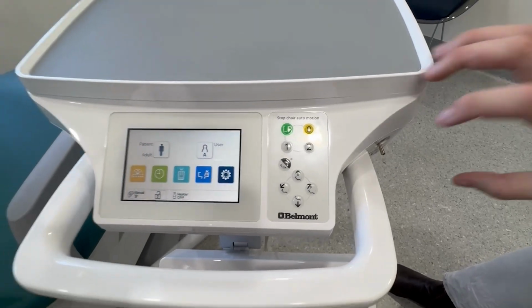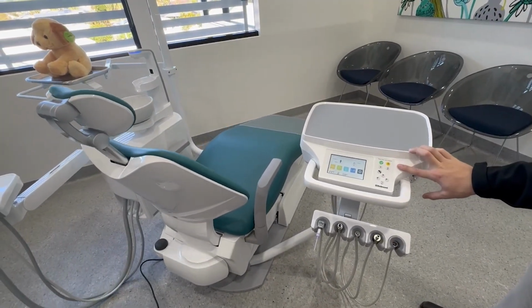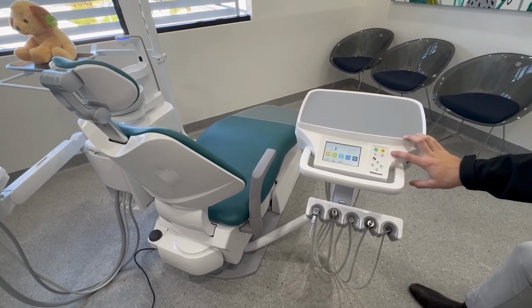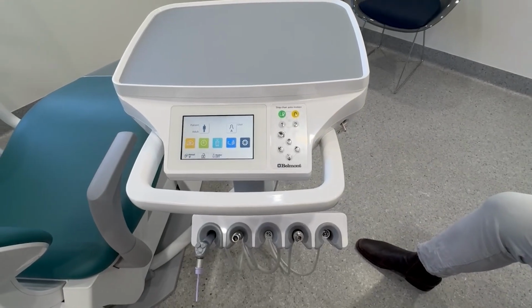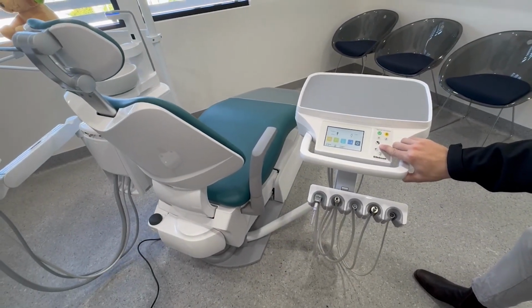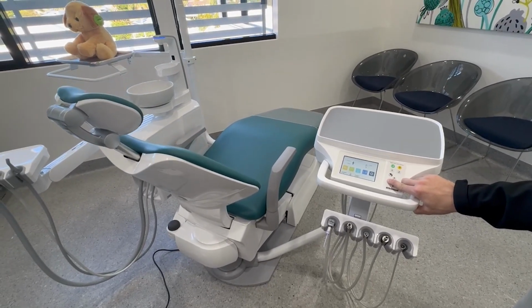Above that, we've got presets. Now 0, that's our entry-exit level. So we hit 0, usually lowest position, backrest up. We can preset that if we want. Then we've got 2 user programmable presets. So let's say we want to set a new position for number 1. Let's manually drive the backrest down and the chair up a little bit. We drive it into the position we want.